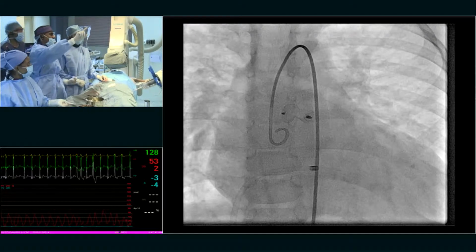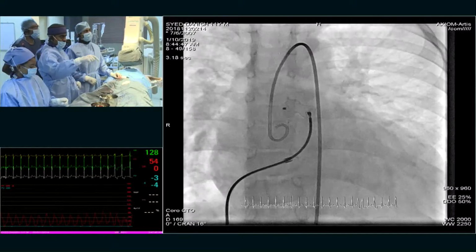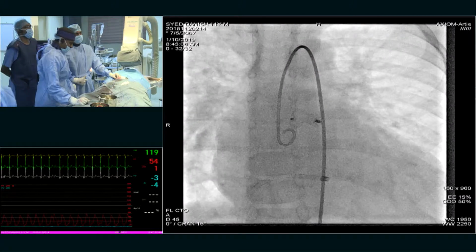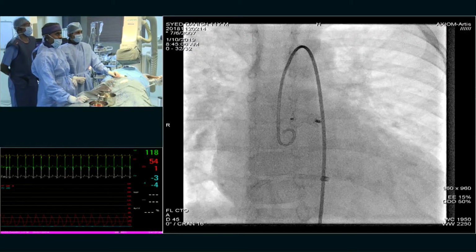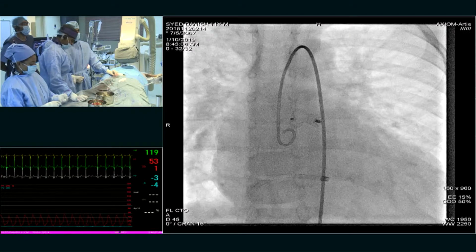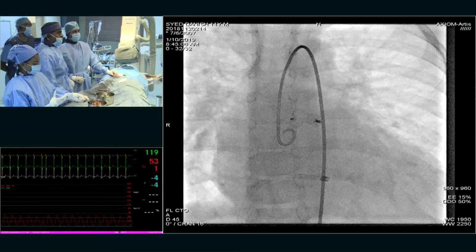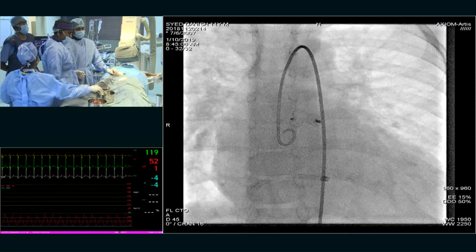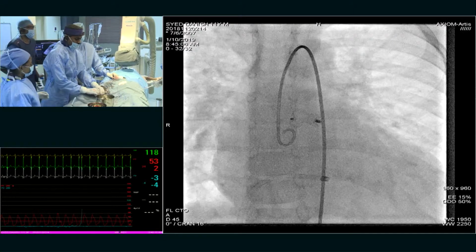Sorry for poking the cable on the right ventricular wall transiently. Okay, another angiogram. Get ready, Mohammed. Last angiogram. Then I will give the hemodynamics. You are ready? The right ventricular pressure is about 55 millimeters of mercury now. Yeah, and the aorta might have gone up, I think. We are waiting for the injector to be loaded. In the meantime, I'll just show you once the aortic pressure live.